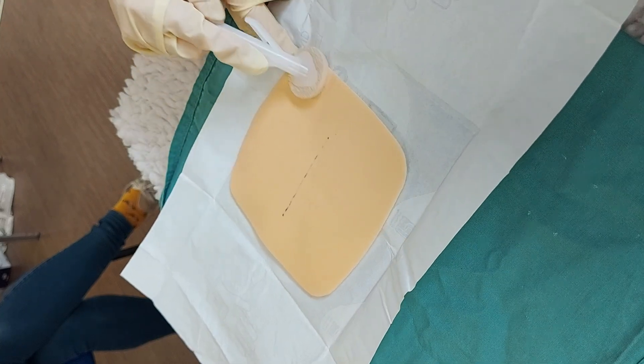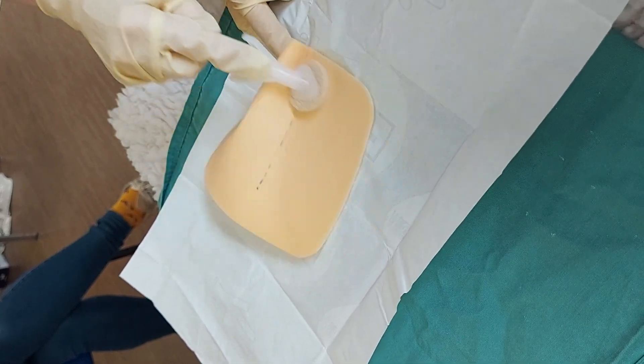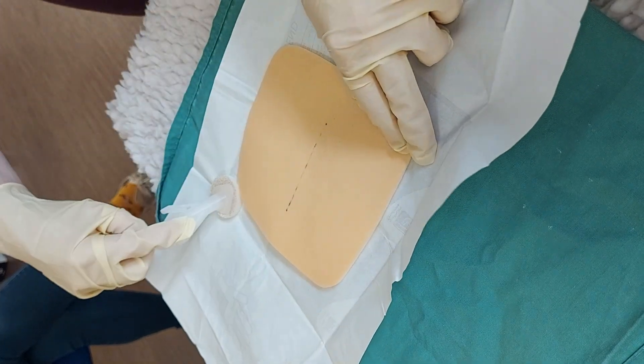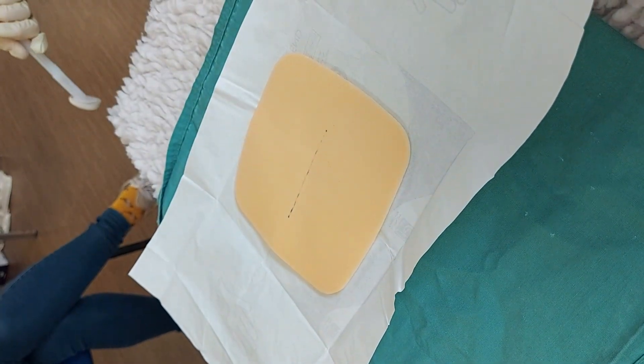Speeding it up — once you've finished, you can do a fold around all the hair edges to flatten the hair down, and then that goes in the bin and disposes of the PPE.